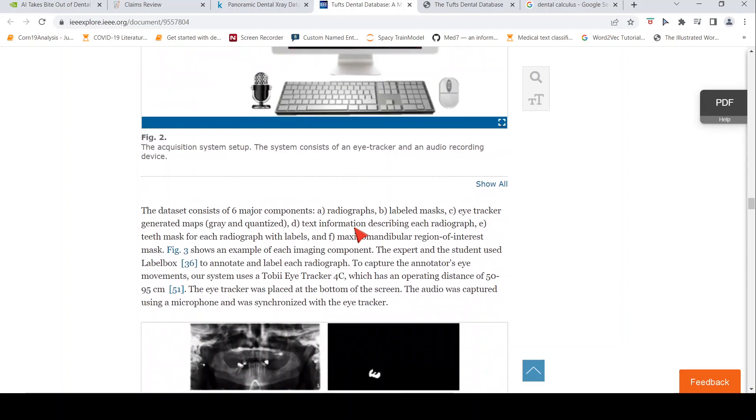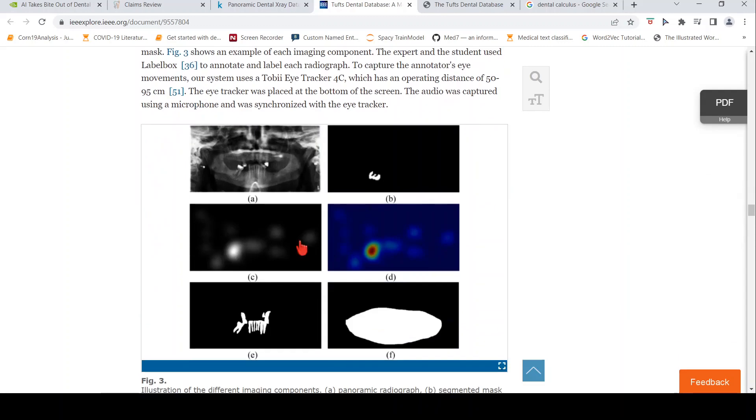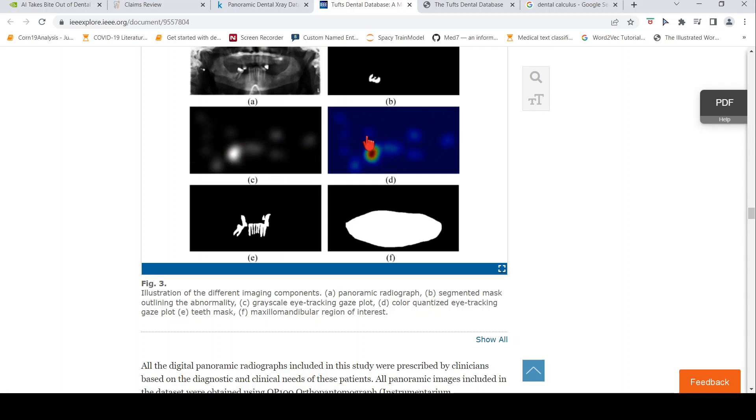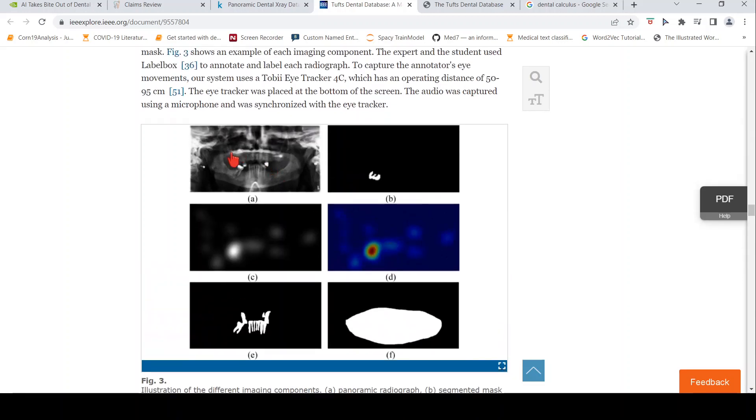These are the kind of annotations available for each image. You have the original X-ray image, the panoramic X-ray image or the radiograph. You have the mask of the abnormality, outlining the abnormality. You have the grayscale eye tracking gaze plot. You have color quantized eye tracking gaze plot. Then you have the teeth mask.